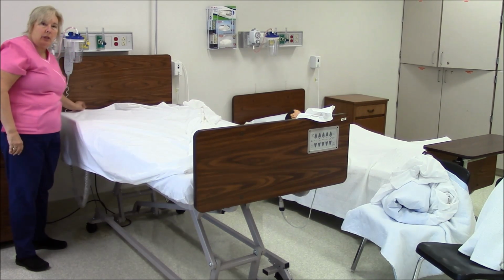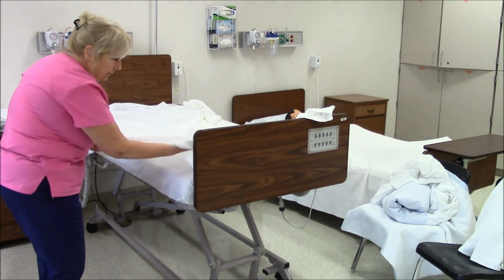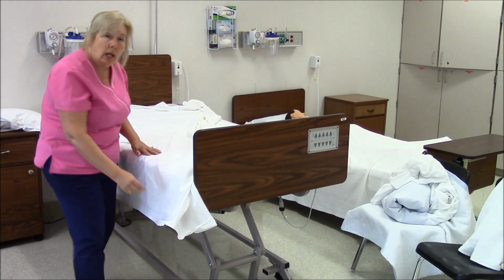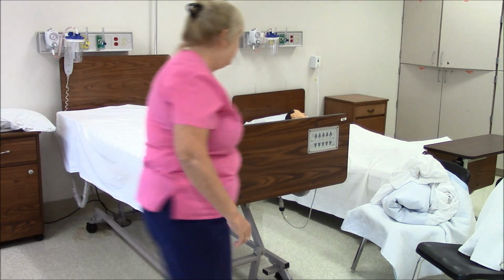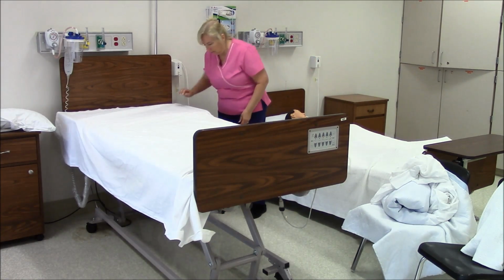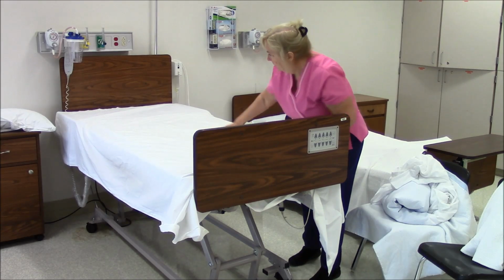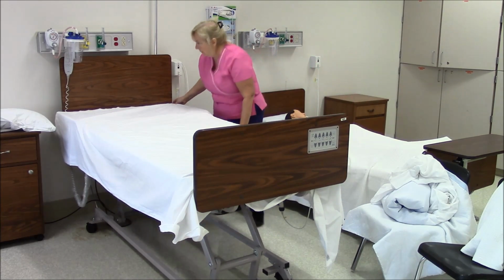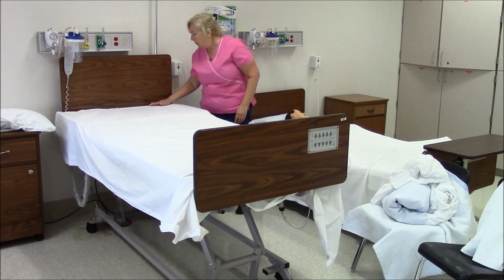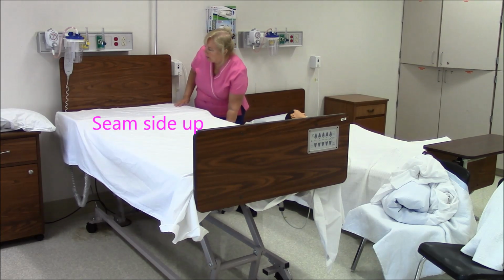I'm also putting the top sheet, as you noticed, right up to the edge of the mattress. And again, like the bottom sheet, you would also like to get as many of the wrinkles out that you can. I now have the top sheet on, and you can feel with your finger the seam side is up. I am now ready to put on the resident or the patient's blanket.